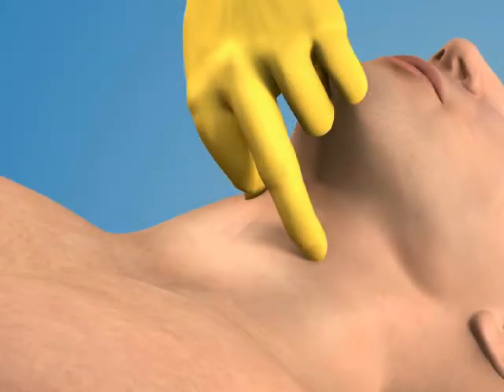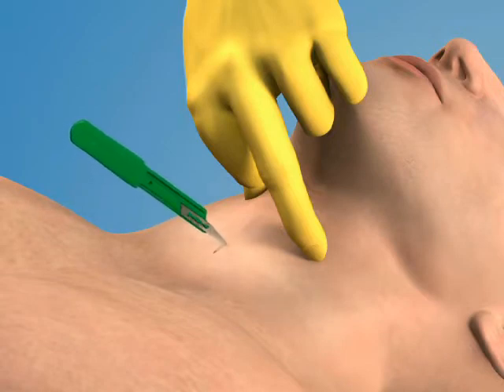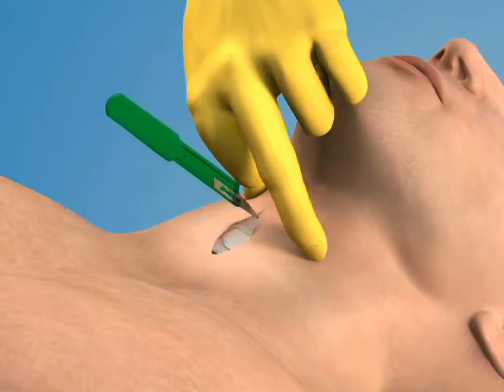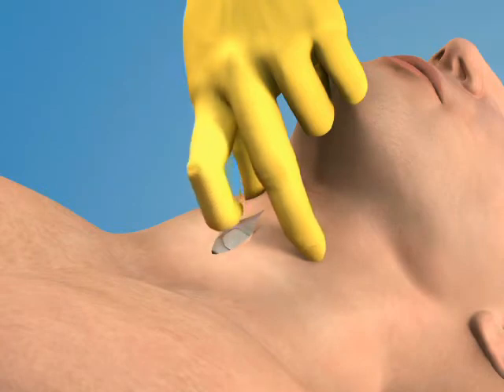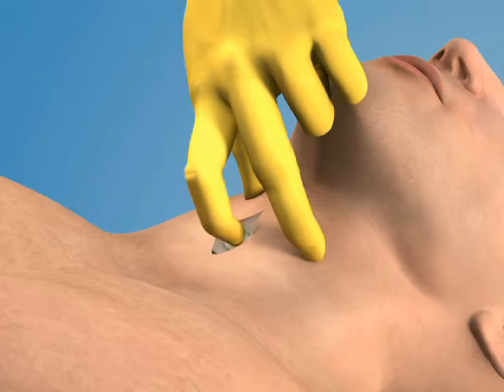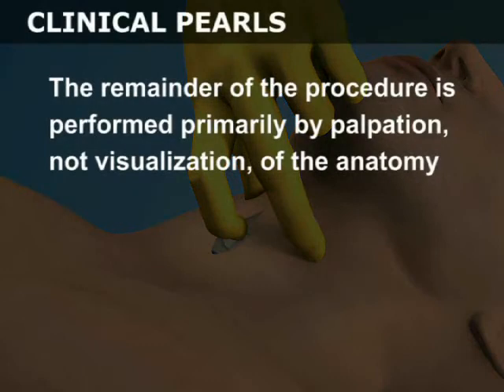Use the 11-blade scalpel to make a 2–3 cm vertical incision through the skin and subcutaneous tissue overlying the cricothyroid membrane. Use the index finger of your non-dominant hand to palpate the membrane through the incision. The remainder of the procedure is performed primarily by palpation, not visualization of the anatomy.